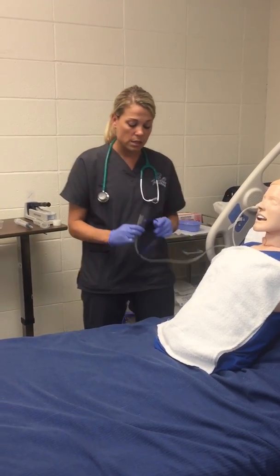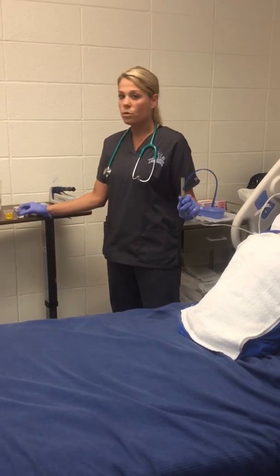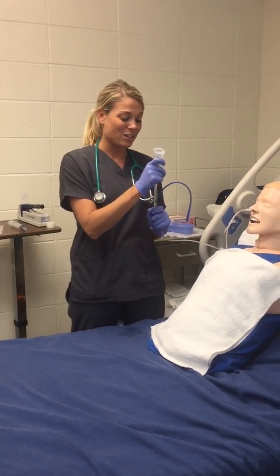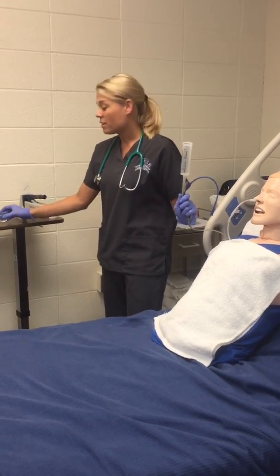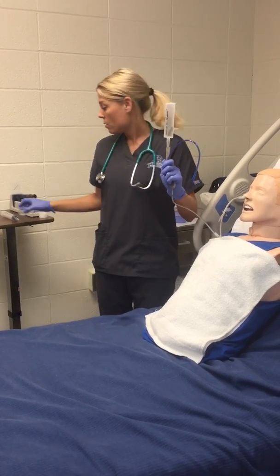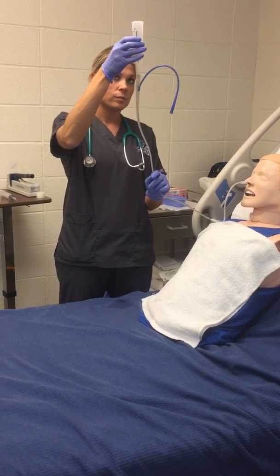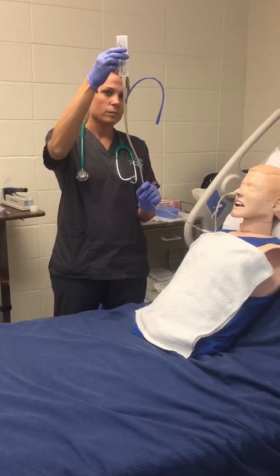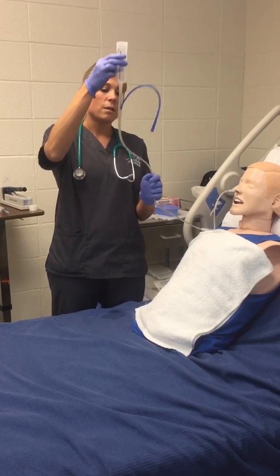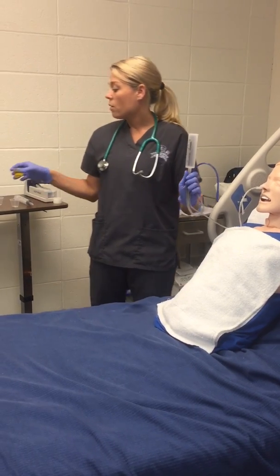So now what I'm going to do is hold the tube and go ahead and clamp it off. And we're going to flush. Well, first we're going to get our piston syringe and attach it on the end. And then we're going to flush with 20 to 30 mils of sterile water. We're going to unclamp and let that go on through. Okay, we're going to go ahead and clamp that up again. And we're going to give our first medication.